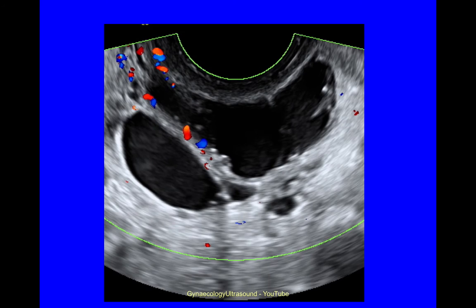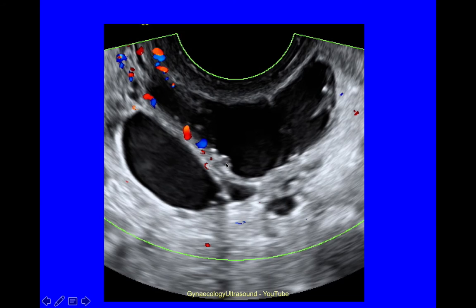Another slightly unusual looking serous cystadenoma — multilocular with more than one locule, no solid material. The septum is very slightly irregular, but these are not papillations or solid material, just a slightly irregular internal cyst wall.